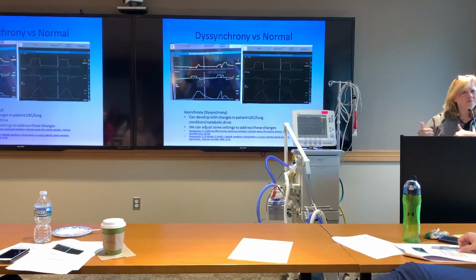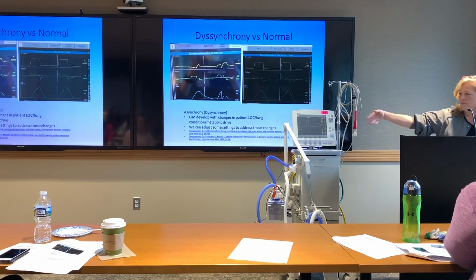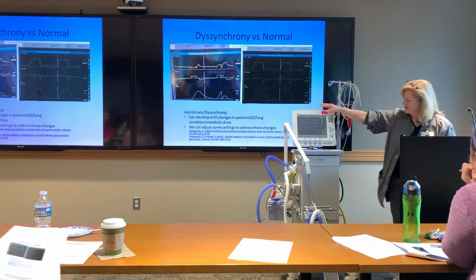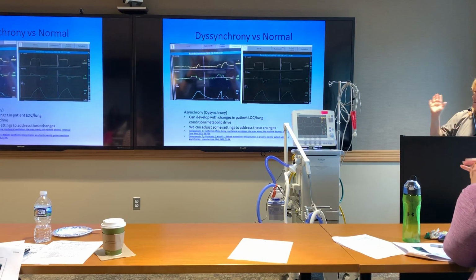No, it just means call the therapist in, and maybe we can tweak the rise time, or maybe we can tweak the cycle off time, or we can adjust some things and maybe improve synchrony for the current level of sedation. Does that make sense? There's always going to be a limit to what we can do, or maybe we have to switch to pressure support or whatever.